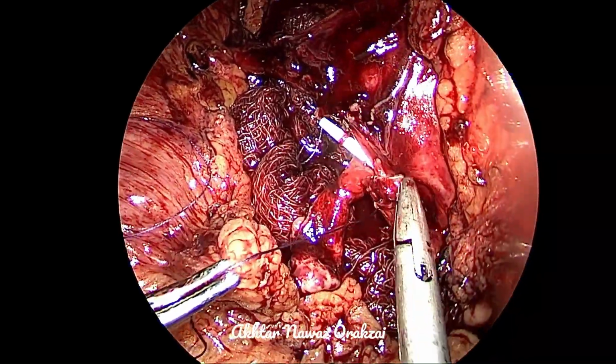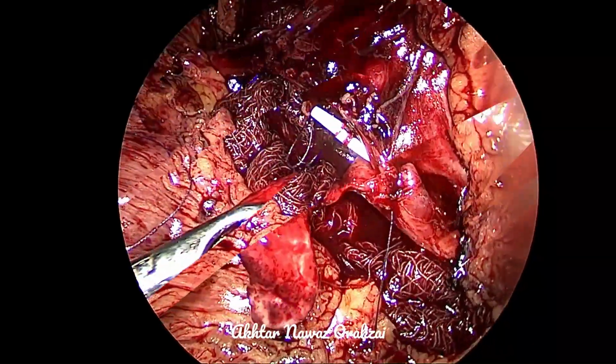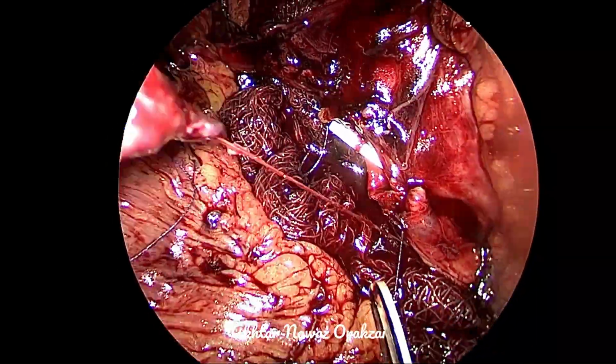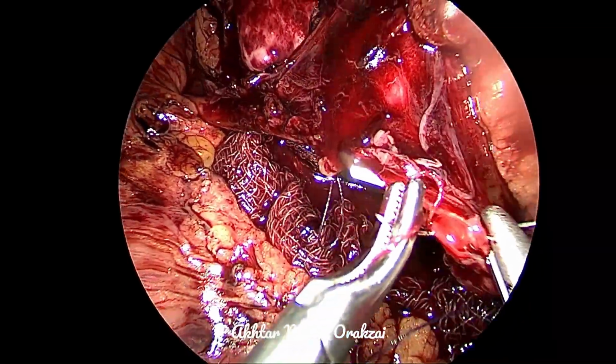So after this stitch, we would like and prefer to excise the remaining portion of the PUJ.